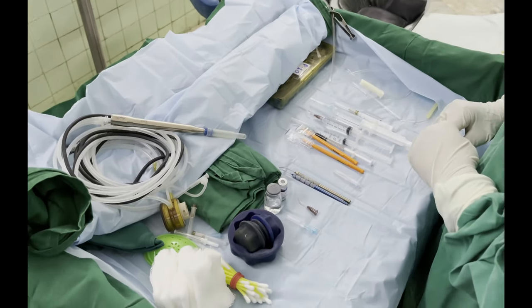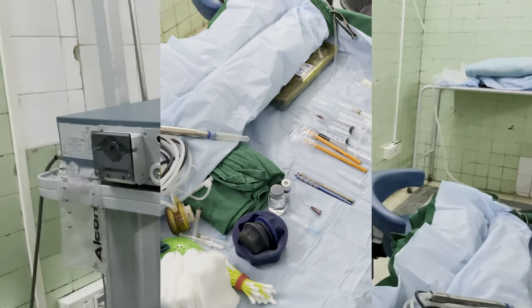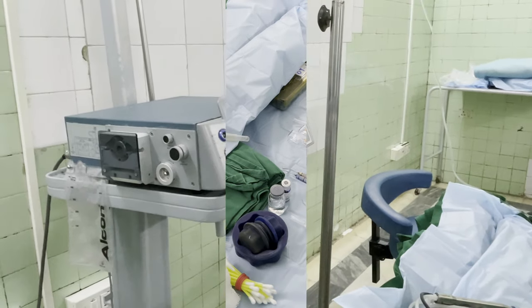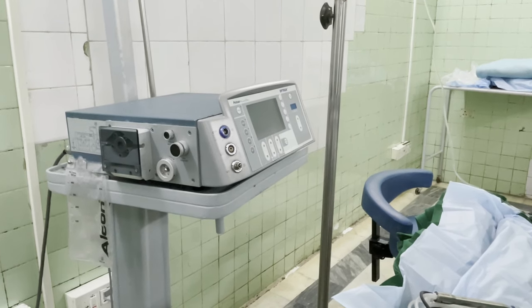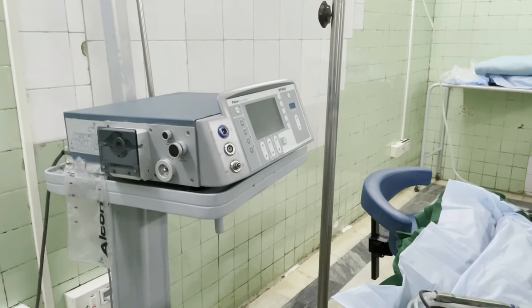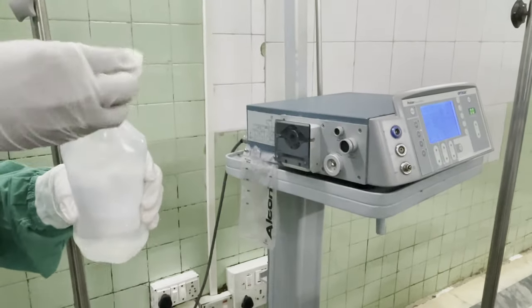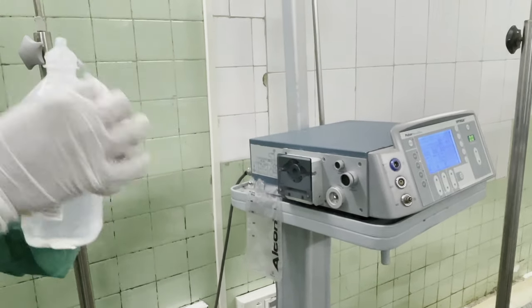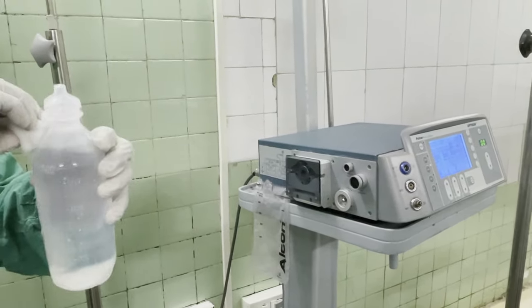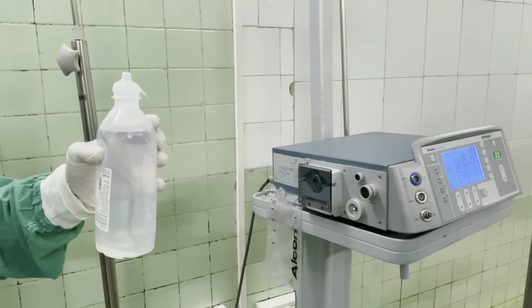We now move towards the setup of the phaco emulsification machine. This is the Opticon machine. So the first step to be done is turn the machine on. So the assistant first cleans the bottle. And here's how the machine setup continues.